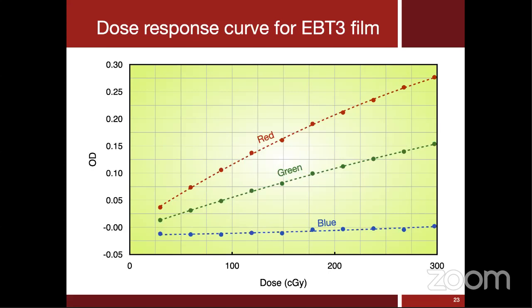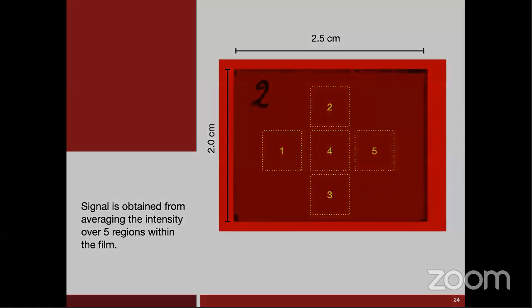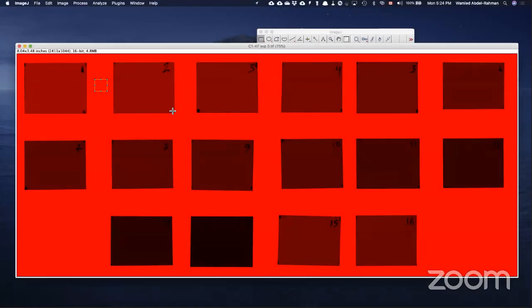True. And that is why I don't take the standard deviation, for example. Let's open ImageJ and take a reading. I'll just show an example. Let's take this region here, and let's look at the measurement. Okay, measure.